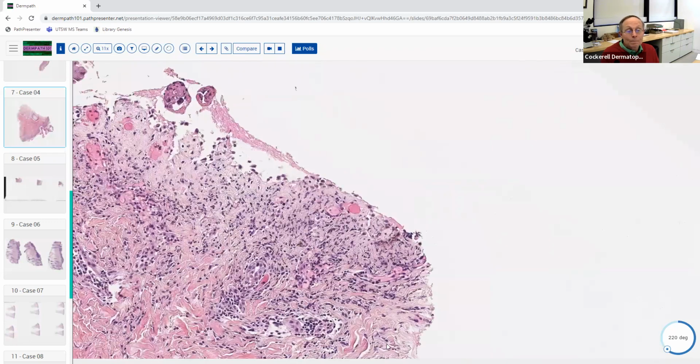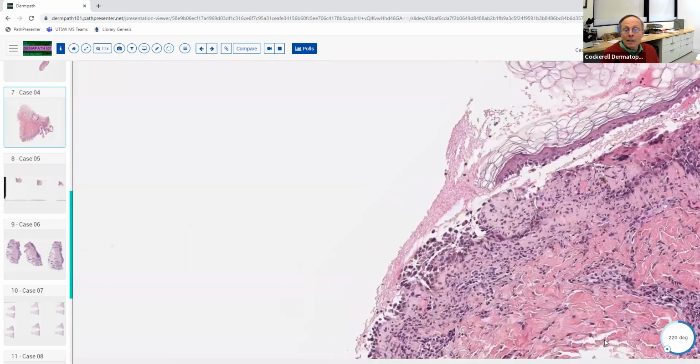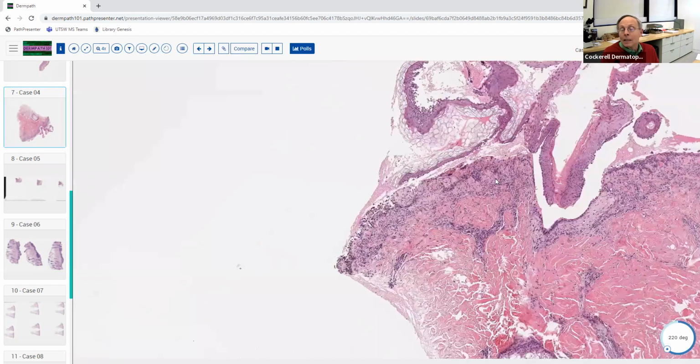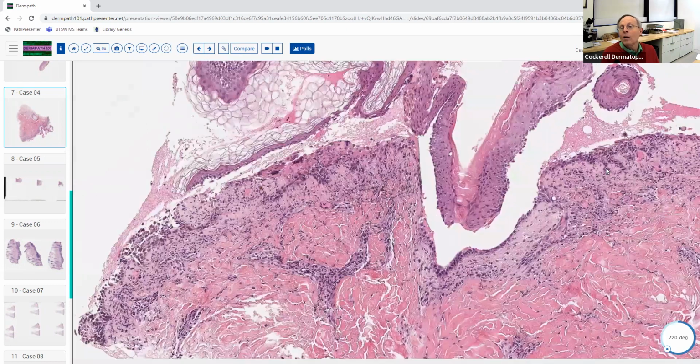If you had the other area that you pointed out a minute ago, you might say, oh my gosh, that does look kind of like Hailey-Hailey. We don't really have the roof of the blister. So you can see why sometimes it can be challenging in the real world, but look for these other features like this and sort of add 2 and 2 together. And yeah, this is going to be Pemphigus vulgaris.